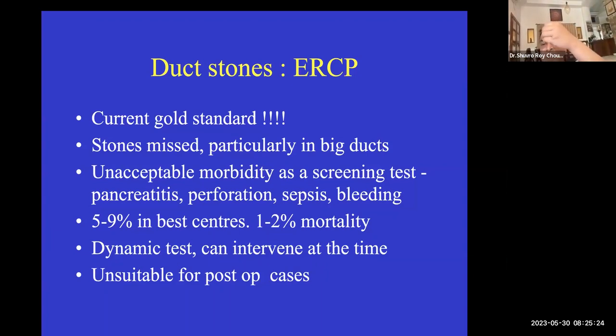You're looking at the bile duct like this, in one plane. You can look at it in 2 planes, 3 planes, 4 planes, but you're looking through the width of the bile duct, right? If it is a colon barium enema, you're looking through the width of the colon. If it is a coronary artery, you're looking through the width of the coronary artery.